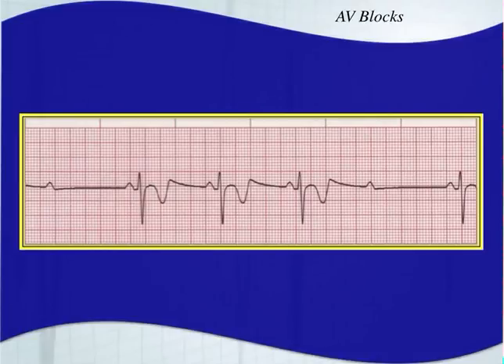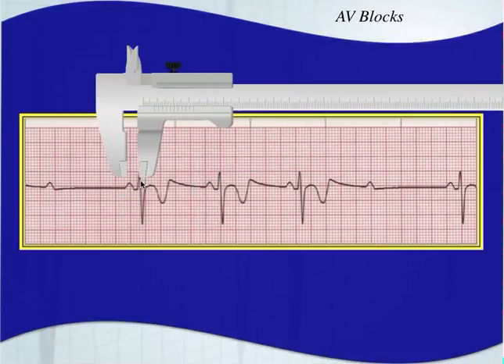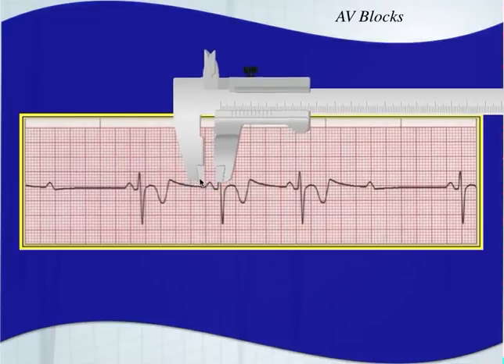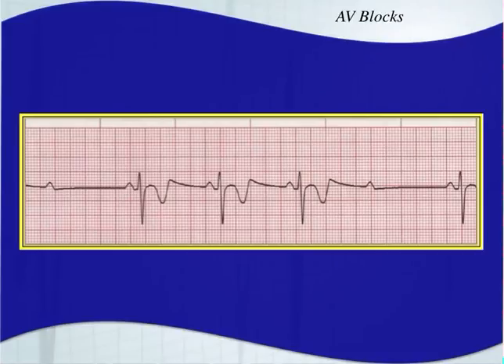Looking at the next strip: is our PR interval consistent? Yes — we have a consistent PR interval for those beats. Do we have dropped beats? Yes — there are P waves without a QRS complex. So this is a Mobitz 2, a second degree type 2 AV block.